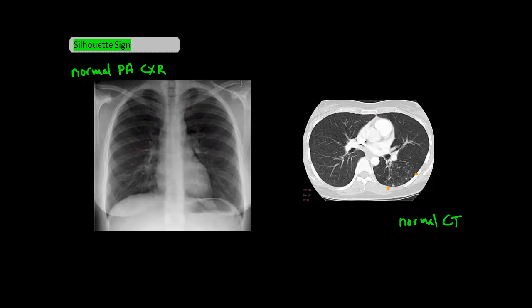As a last example, let's look underneath the right diaphragm. We know that the liver is right underneath it, but we're not able to see a distinct border between the right diaphragm and the liver. That's because both these structures fall under connective tissue and hence are of similar densities. So whenever there are areas of similar densities next to each other, there's no border on a chest X-ray.